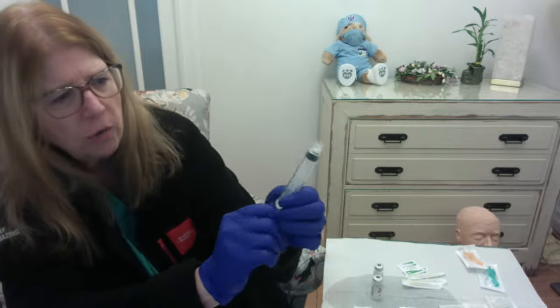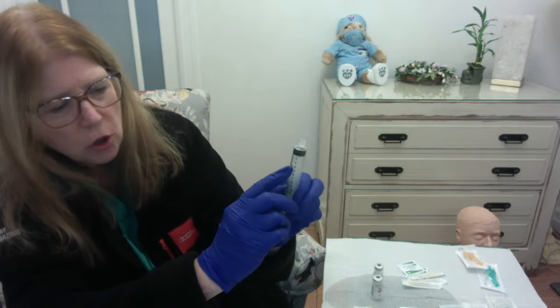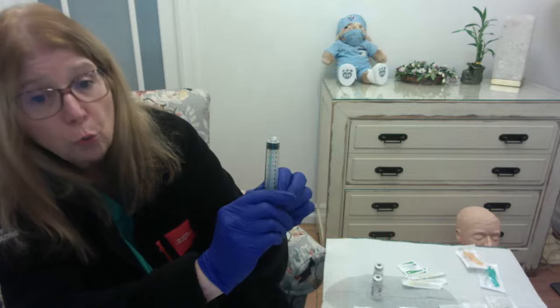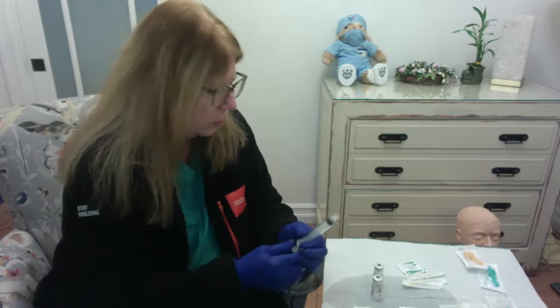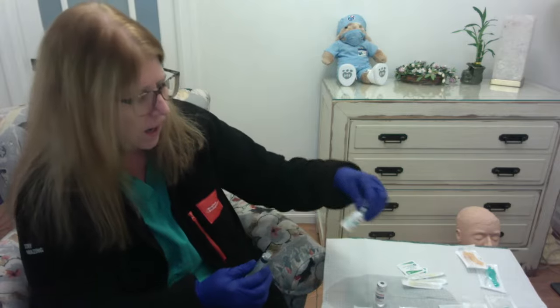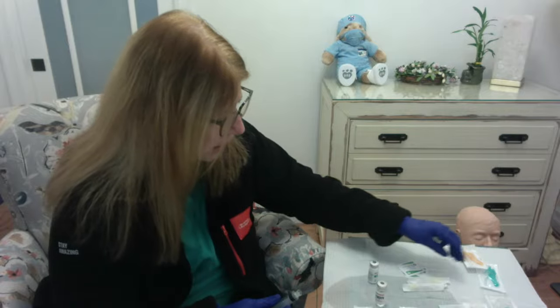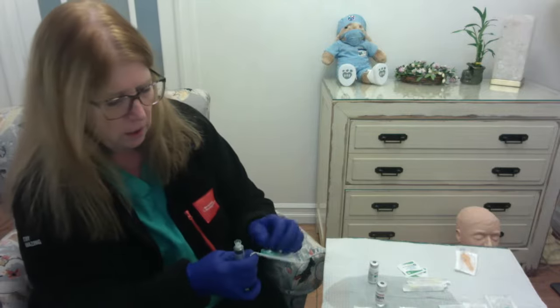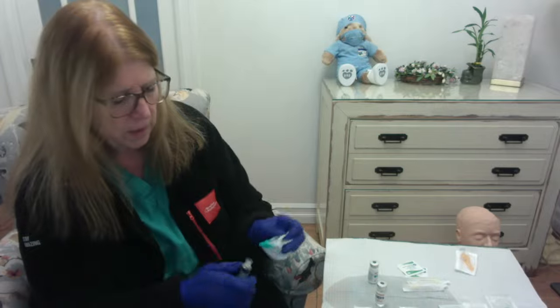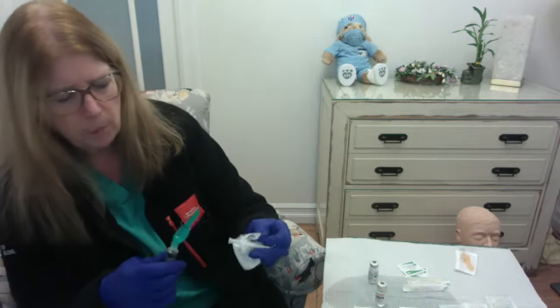The big lines are 1 milliliter apiece, and then each little line in between is 0.2 milliliters, okay? So it told me I need to put in 7.5 milliliters of diluent. So let's get a nice size needle here, right? And I'm going to put the syringe together with this needle, okay?